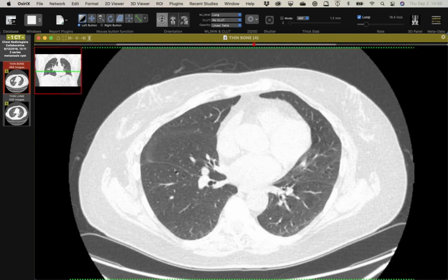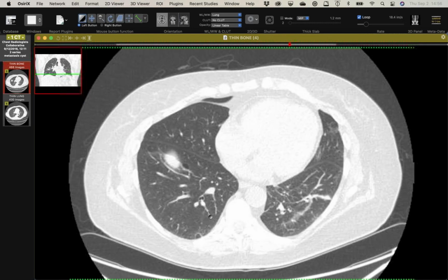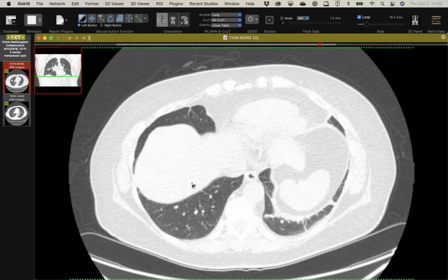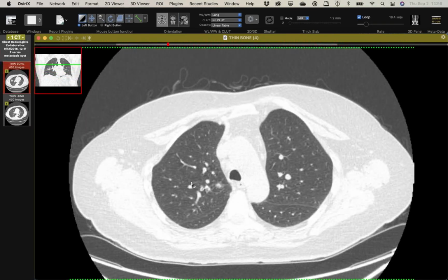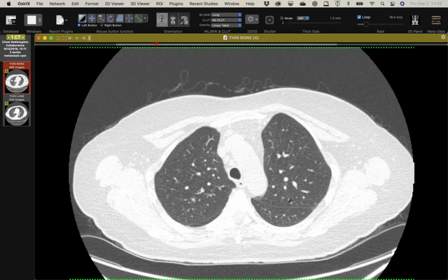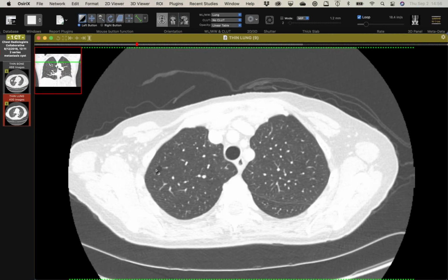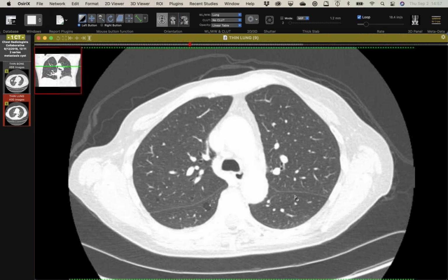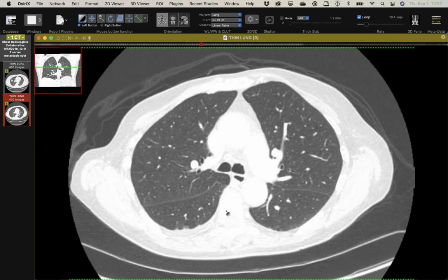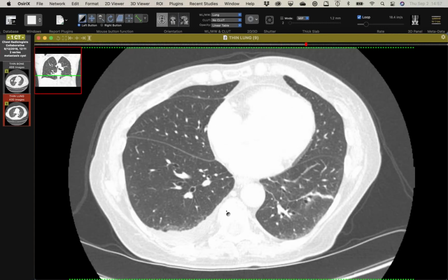But what I want to point out are these small cysts in the lung, and you'll see that they're very small, perivascular, thin walls, no real distribution, a couple more here and there. There's another one right there in the left upper lobe. And I came across this one here. So we're following up, and you'll see that the cysts are more conspicuous. There's probably a few more of them. They're definitely bigger. And they kind of look like LIP type cysts, amyloid cysts, or light chain, in that they're perivascular, very smooth. It doesn't have the distribution of LAM, and it's not polycystic disease.